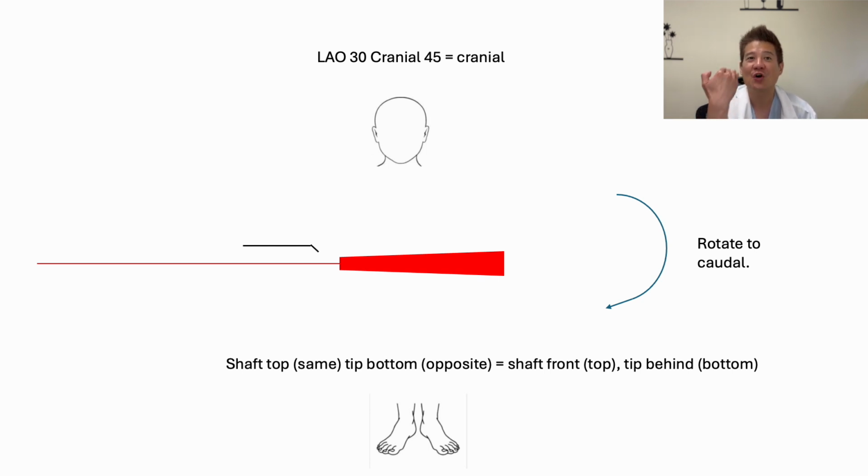What is on the top is the head of the patient. What is on the bottom is the feet of the patient. And we all know this. When we're wiring a distal RCA, if the wire is on top of the target in distal RCA, it's actually on top of the vessel. If the wire comes below the RCA, it's actually under the target. We know this. It's nearer the stomach of the patient. But in this angiographic view, we work it out in Okamura language.